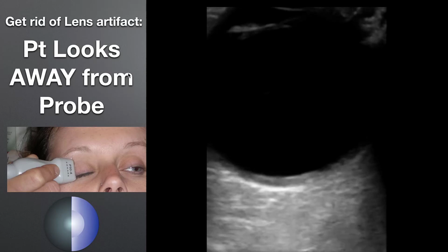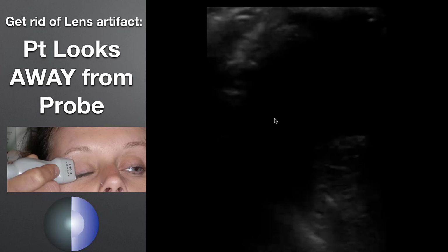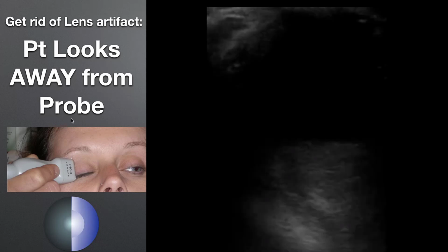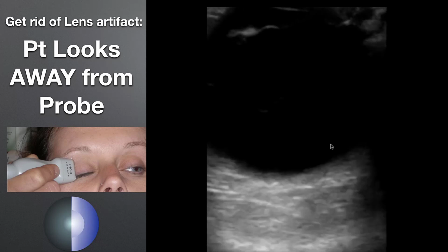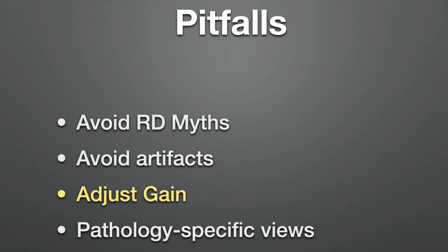The good news is that this is a really easy artifact to fix. You just have the patient look away from the probe. So you have them look in the opposite direction of where you're scanning, and then usually that gets the lens out of your way so that you can then see the back of the eye without too many problems. The next thing that I want you to be aware of is that your gain is significantly affecting what you're seeing in the eye.